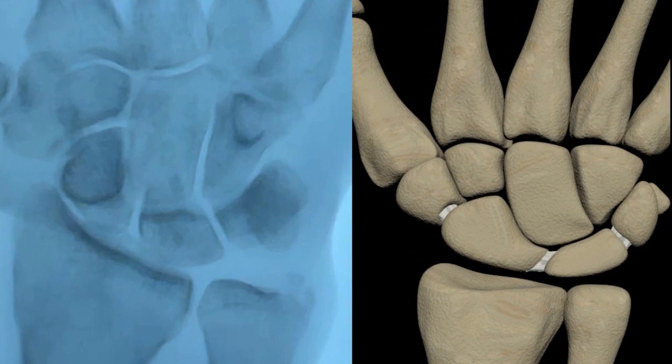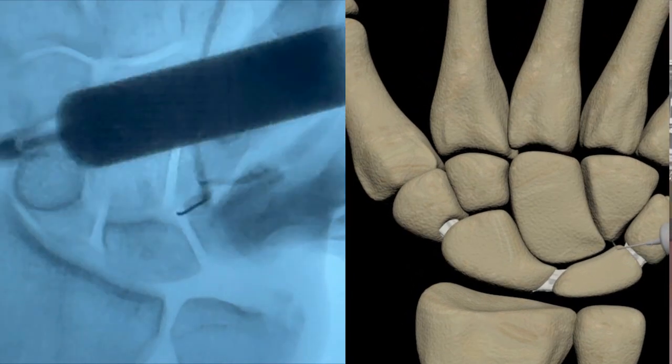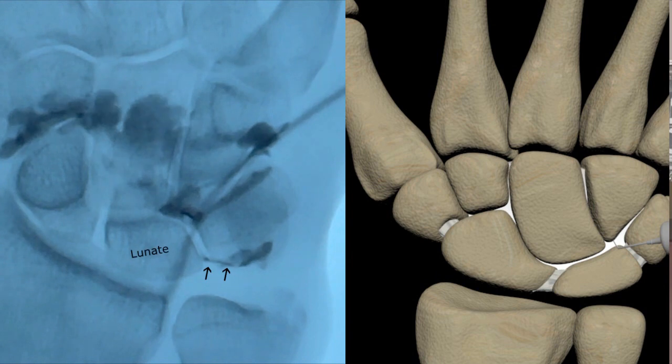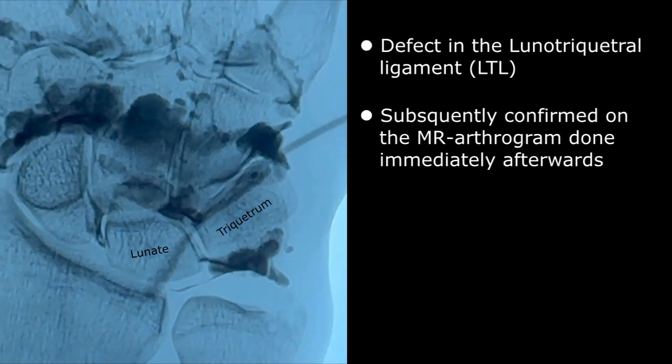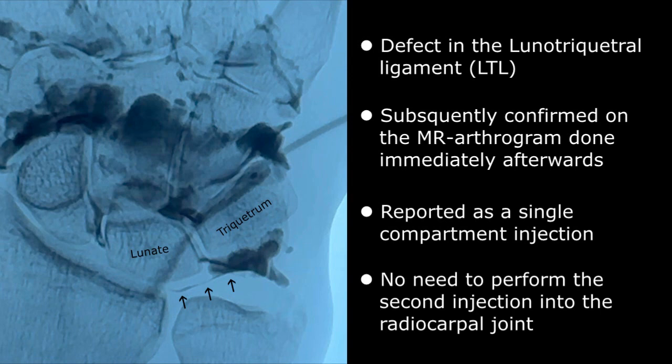Let's zoom in and look at the arthrogram a little closer. Almost immediately after injection, you can see a stream of contrast passing between the lunate and triquetrum, indicating a defect in the lunotriquetral ligament, which was subsequently confirmed on the MR arthrogram performed immediately afterwards. This would be reported as a single-compartment injection with contrast identified in the proximal and distal joint spaces consistent with a suspected ligamentous injury. Since contrast spontaneously entered the proximal joint space, there was no need to perform a second injection into the radiocarpal joint.